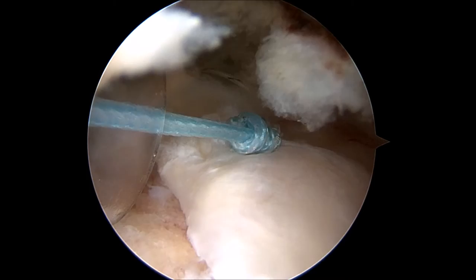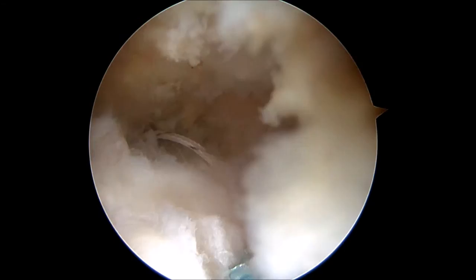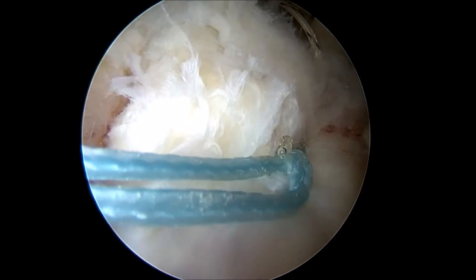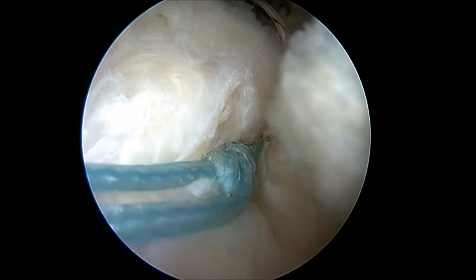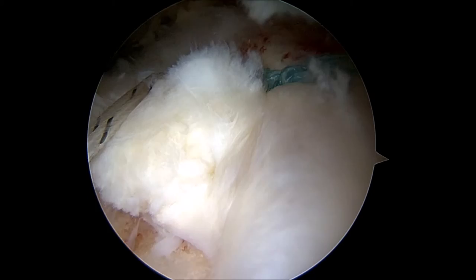The two blue sutures are tied to one another using an arthroscopic knot tying technique. As the knot is secured, you can see how the rotator cuff tendon is pulled down to the bone on the humeral head. After the blue knot is completely tied, the white sutures will be tied in a similar fashion in the front of the repair. After both knots are tied, you can see how the rotator cuff tendon has been reduced or pulled down to the bone. The previously seen gap in the rotator cuff is no longer visible.